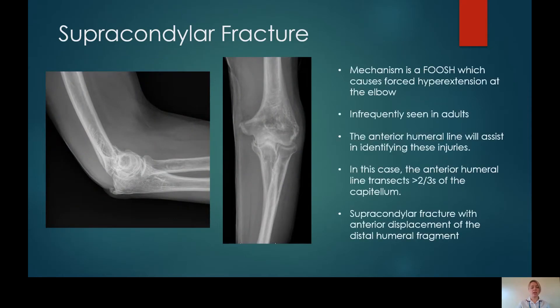This is an example of an adult supracondylar fracture. The mechanism is frequently a FOOSH injury, and although less commonly seen in adults, it is more likely seen within the elderly population as opposed to the young. When we use the anterior humeral line, you'll see that more than two thirds of the capitellum is being bisected — so this is an example of an anteriorly displaced supracondylar fracture. Note that the posterior fat pad is not actually present on this X-ray, although there is a fracture present.